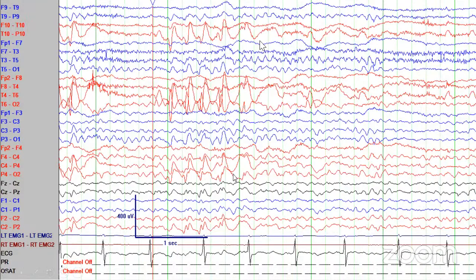Plus, right now what we see is this sinusoidal activity happening over the temporal electrodes. Basically, when we have up and down movement of the eyes, it is picked up as an eye blink over the frontal electrodes. But once you are transitioning towards sleep and you have those roving, slow, sideways movements, they are picked up in the anterior temporal electrodes.